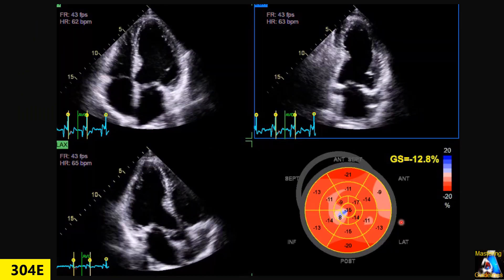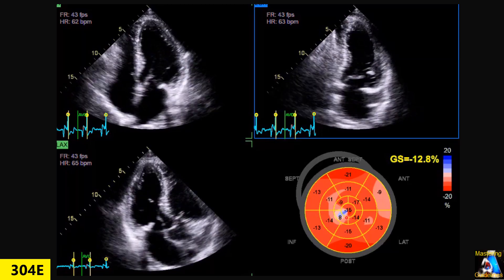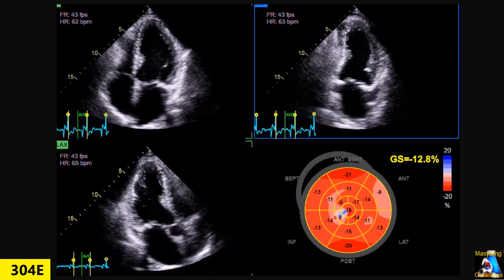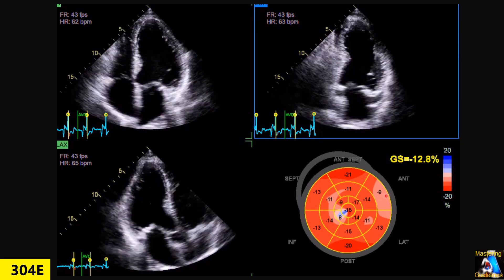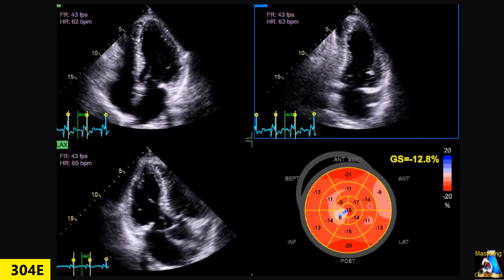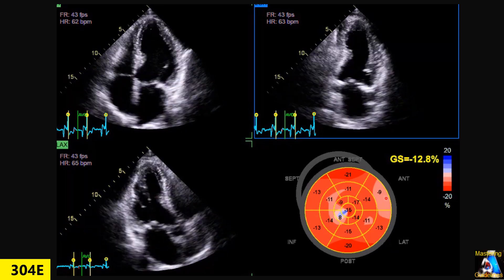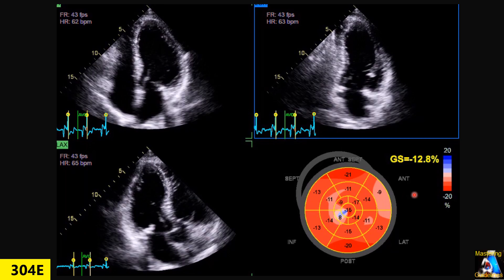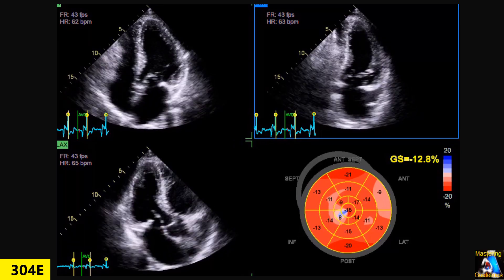Based on all those views and the strain analysis, you can prove you are right. At the inferior apical segment, we have inferior apical dyskinesia — shown in blue — and severe hypokinesia in other segments is very obvious. Those numbers represent scattering hypokinesia and dyskinesia in different segments, and the global strain is completely abnormal. The most important are those segments that exactly correspond with what we discussed on 2D.